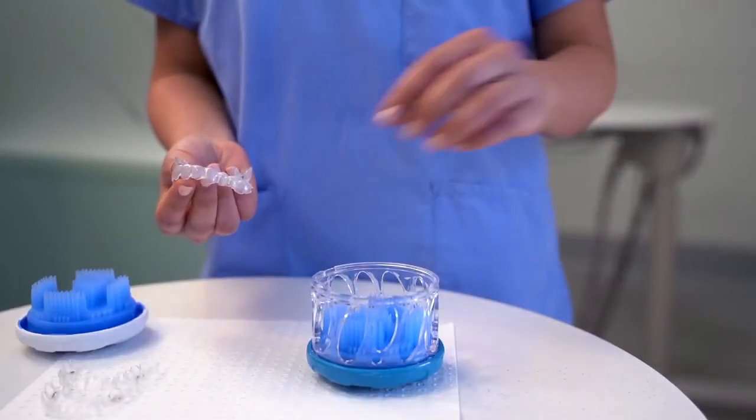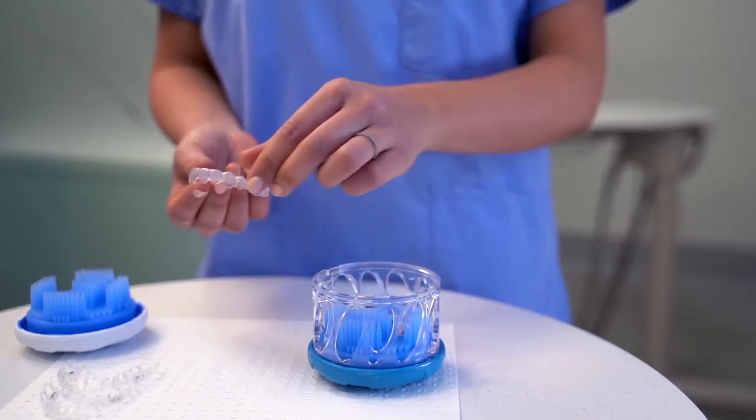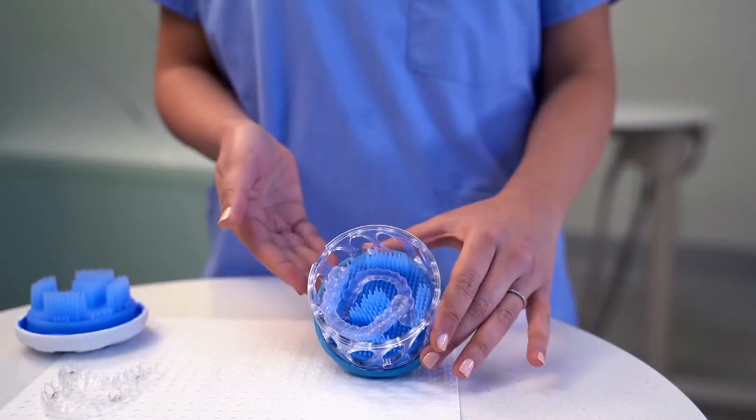When washing two at a time, place the first one inner side up and the second one inner side down. Just like that.